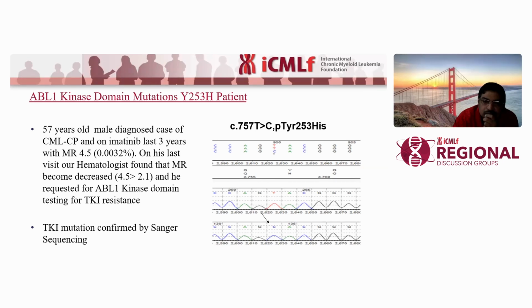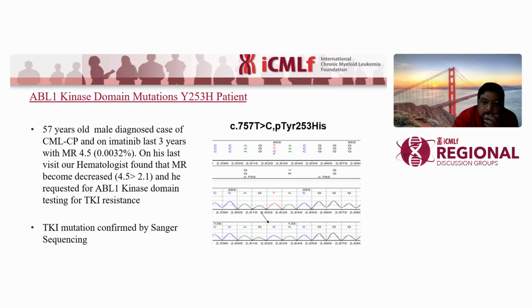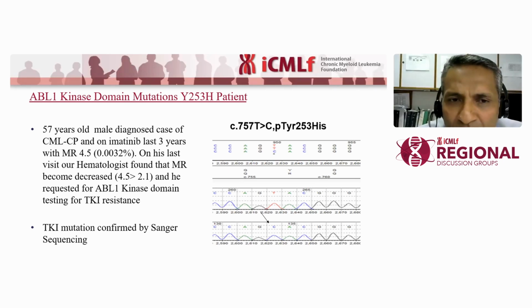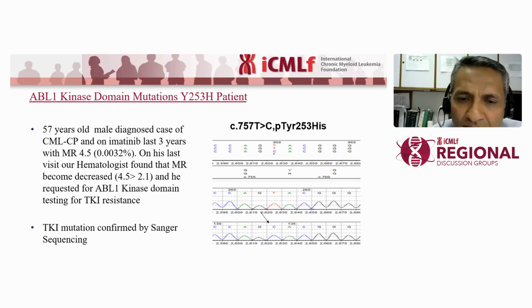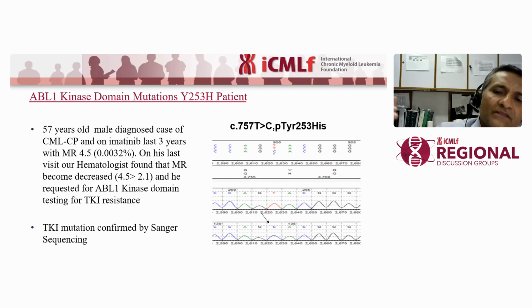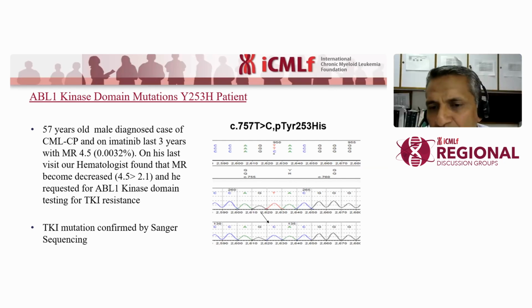Dr. Mishra is also discussing that RNA is very sensitive, so it needs to be stabilized. If we don't have the amplicon in the nested PCR, we will not go further to run the sequencing. So this is the first step, which will tell you whether this specimen is ideal for sequencing or not.